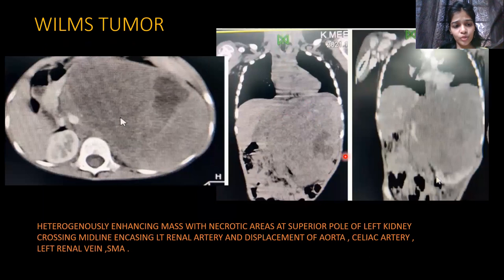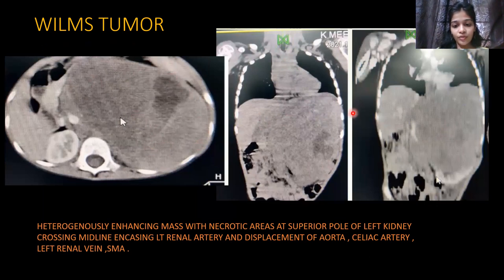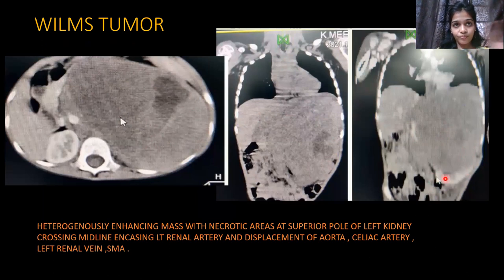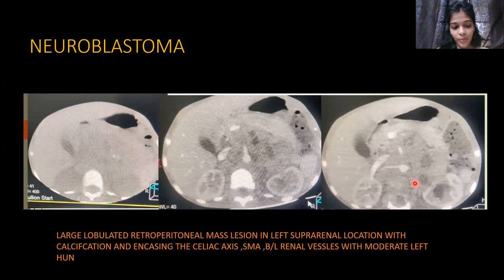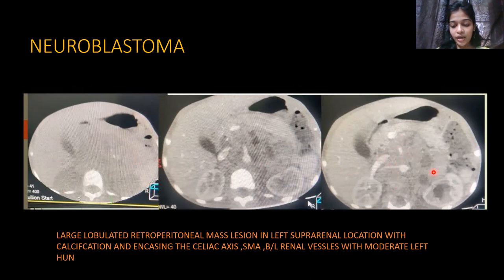This is a Wilms tumour — a heterogeneously enhancing lesion that crosses the midline, with areas of non-enhancement. The organ-embedded sign on the left kidney is positive. Next, there is a large retroperitoneal mass in the left adrenal region showing calcification with areas of non-enhancement, causing encasement of the coeliac vessels and SMA, and a left-sided ureteric obstruction due to mass effect.